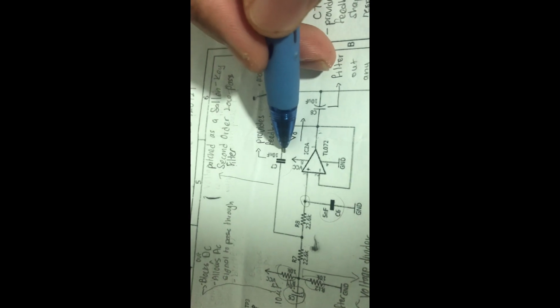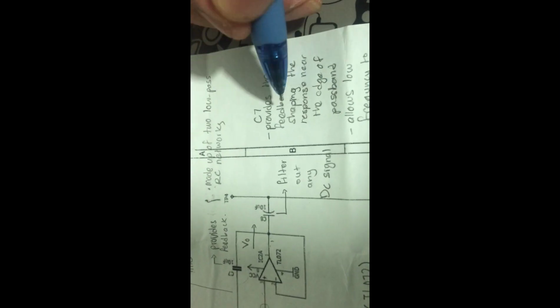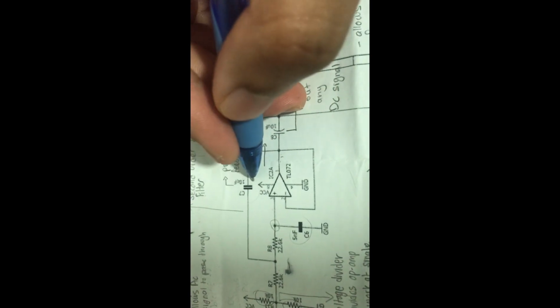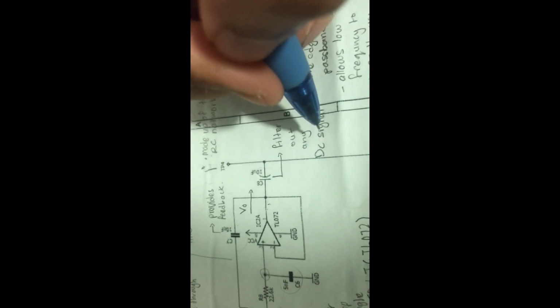Okay, so let's see. This C7, which is a capacitor with a value of 10 nanofarad, provides feedback. This circuit itself is already made up of two low pass RC networks. What type of feedback does C7 provide? C7 provides the feedback for shaping the response near the edge of the passband and allows low frequency to pass through or filter out high frequency. So that is the function of this capacitor here. Then Vout will be passing through C8 here. C8's main function here is to filter out any DC signal.